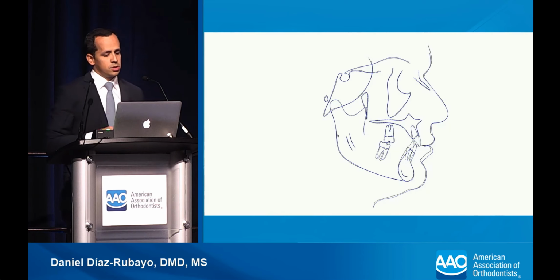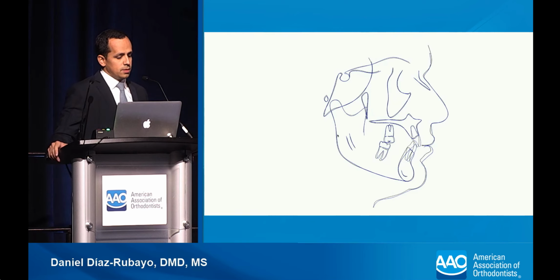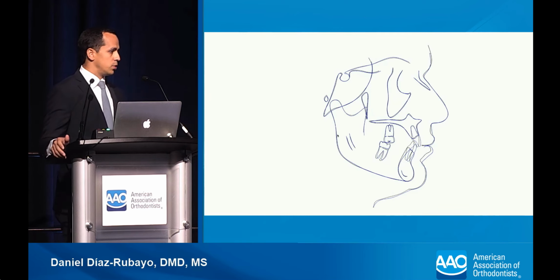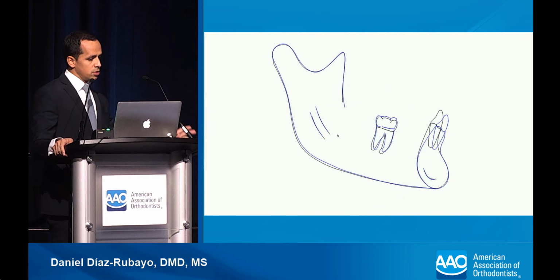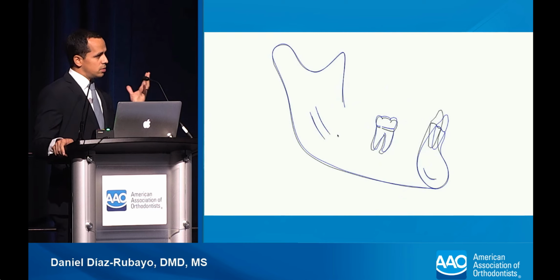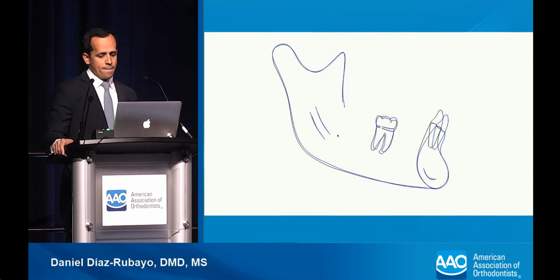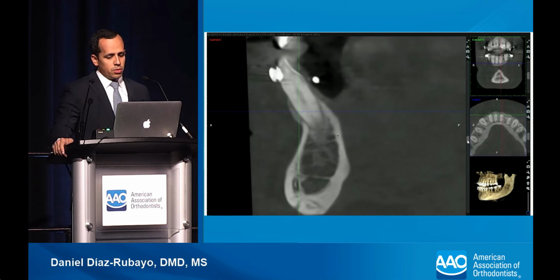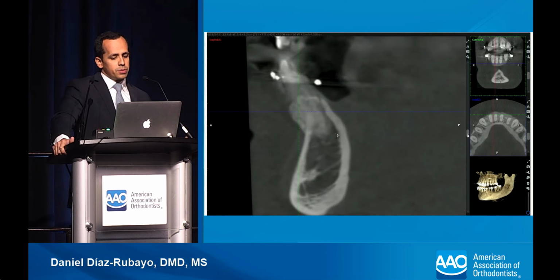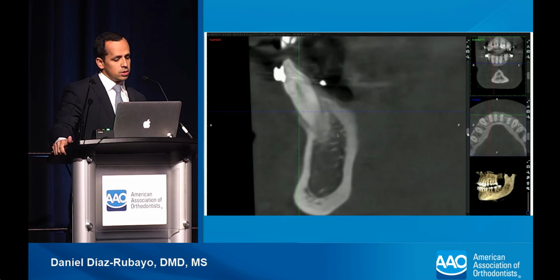Okay? And this is a superimposition, another superimposition. So as you see, we love superimpositions because you can actually see what's going on, if you do it right, of that movement that we've had. And we're going to focus on those lower incisors. You can see it's a little bit of proclination, but it's more a bodily movement. And then we took a progress cone beam where you can see the current position of those incisors and how much bone there is still buccal to the incisors.